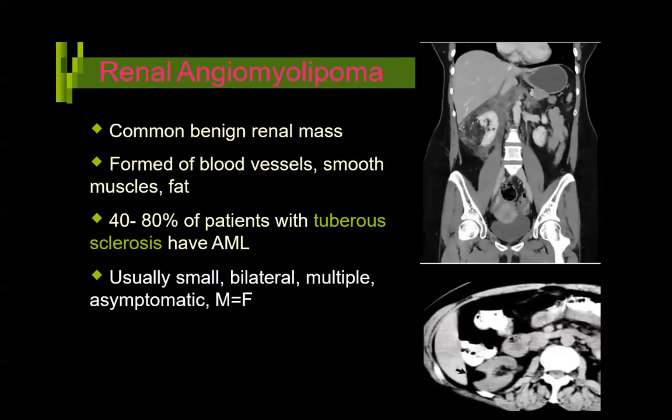Okay. So this is another angiomyolipoma in the kidney, which is the right kidney. And if you look carefully, there is some fluid around it. So this has sort of bled inside. So sometimes you would have bleeding as a complication of angiomyolipoma. As I've told you, these are abnormal vessels inside these tumors, which are leaky sometimes and form aneurysms and can bleed.